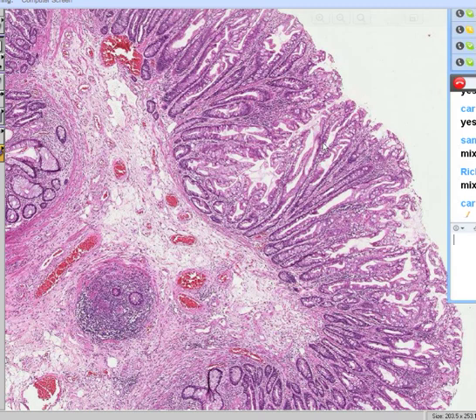Okay, you all agree. It's a mixture. Good. So if it's a mixture of cells, it means it's probably not clonal, right? So if it's not clonal, it's probably not a true neoplasm. So let's get back to the final diagnosis now.